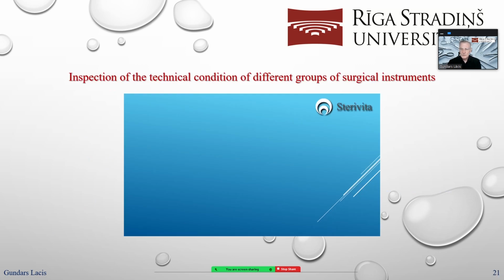And now a small video of what we can check during this inspection and maintenance. Actually, you as medics and doctors in the future, please understand that sterile technicians cannot detect all defects. Yes, we can check, we can control, but not everything, because we have no contact with the patient, we have no possibility to check this instrument in real function.